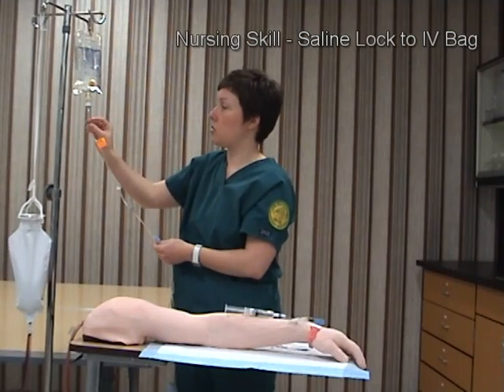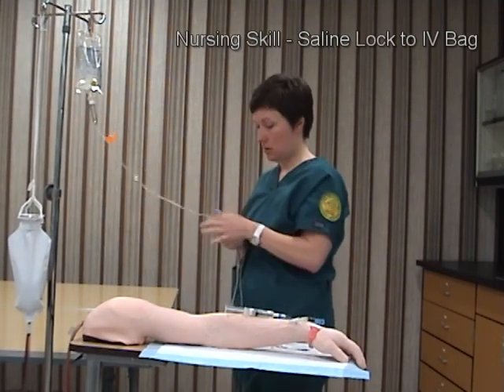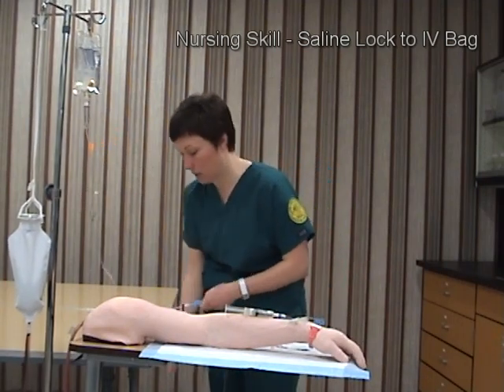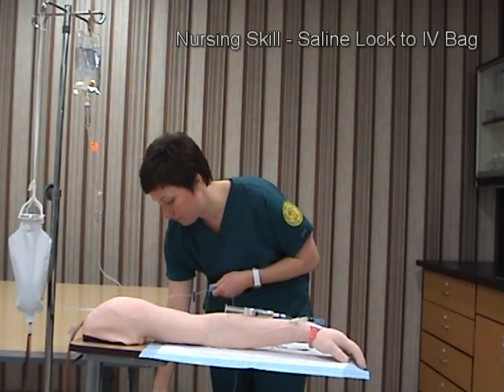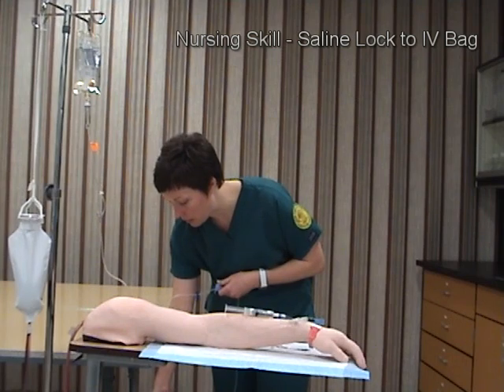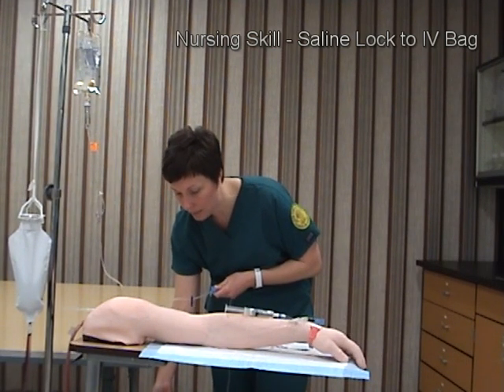I'm going to fill the drip chamber up about one-third to one-half. I'll remove the cap on the end of the IV line and open the roller clamp to get a free flow through the line. This ensures there are no air bubbles. Once I get a nice free flow, I'll lock the roller clamp.